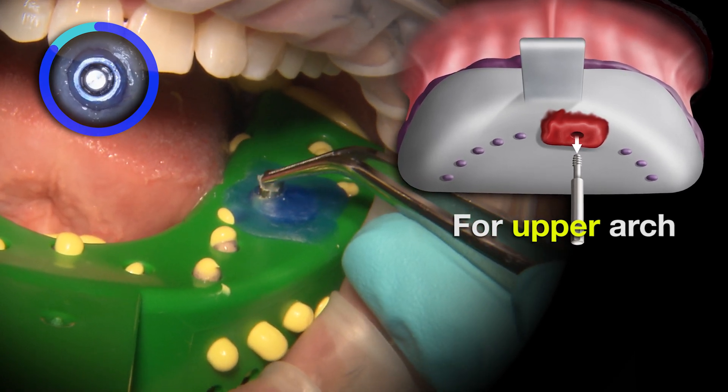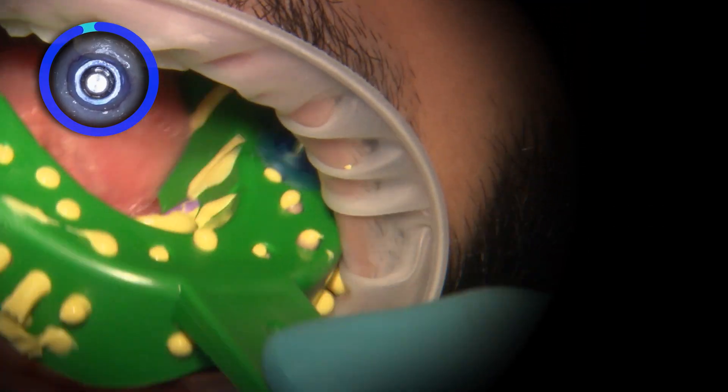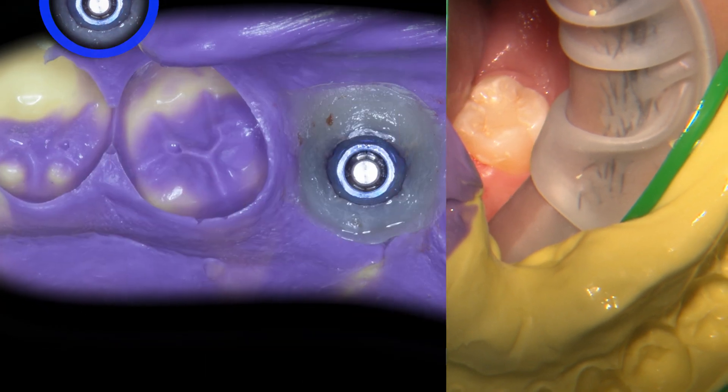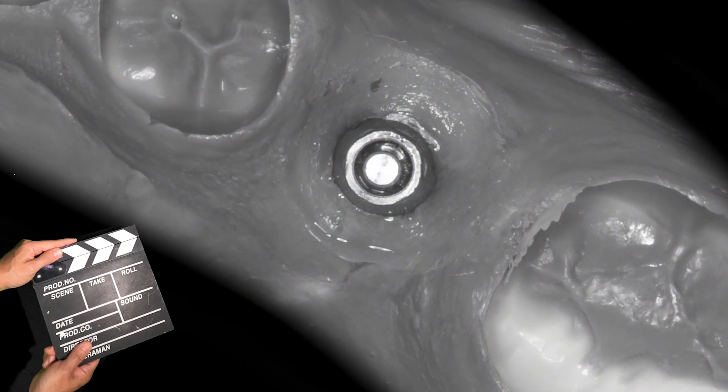Once it's removed, take a look at the impression — you can see the impression coping stayed in the tray. No need to reinsert the coping afterwards. The implant analog can then be attached to the impression coping either by the clinician chairside or by the laboratory technician prior to model work being completed.